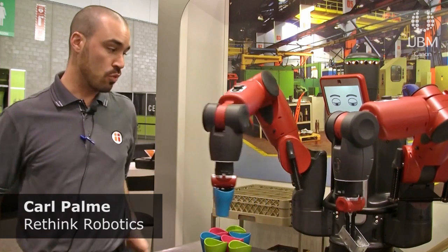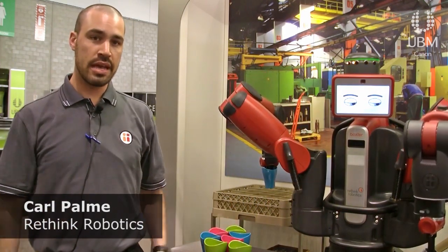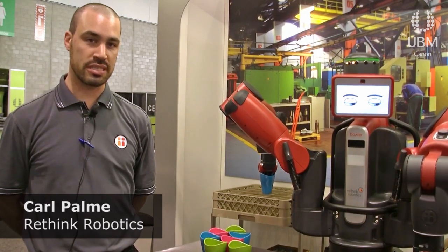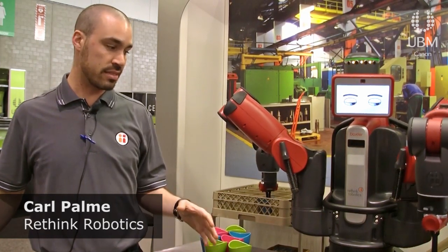Baxter is a robot that can work alongside humans — it's very safe. As you can see, there's not a cage around it. One of the nice things about Baxter is that because it has two different arms, it can be doing two different things at exactly the same time.